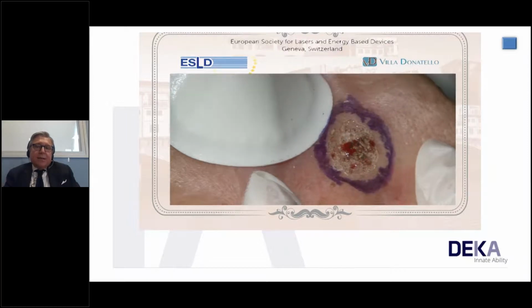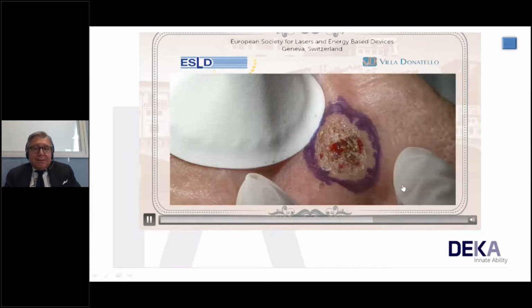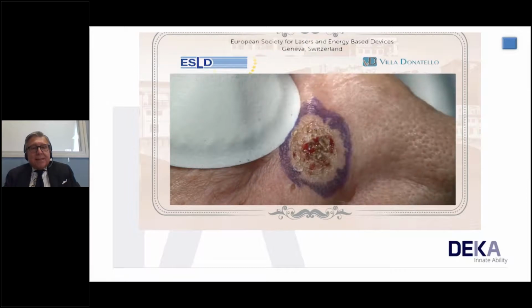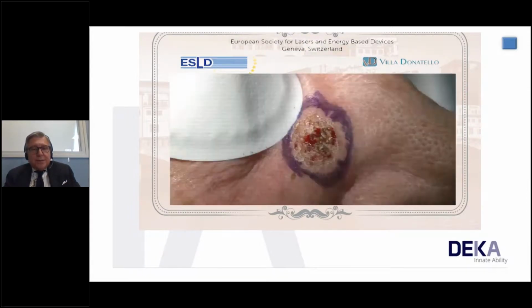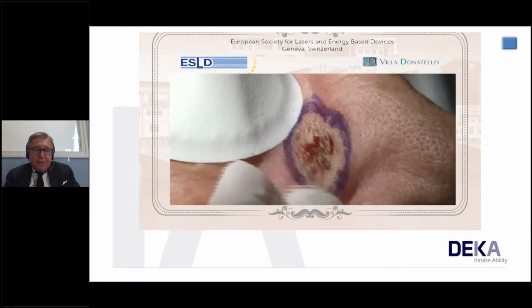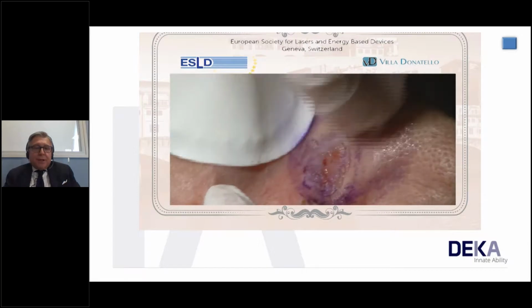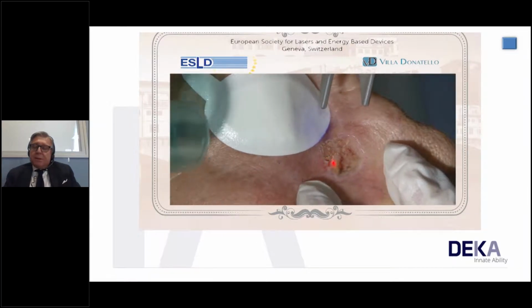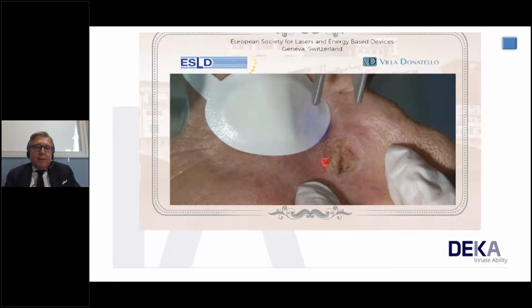conservative in the sense of the cosmetic results, because we and our patients have one common goal: to be precise, time effective, and above all, to ensure safety all the time. So with this kind of procedure, we can reach all these goals. You see, we need to remove the necrotic debris, as I already explained in the previous slides, until we get the final steps of this treatment.